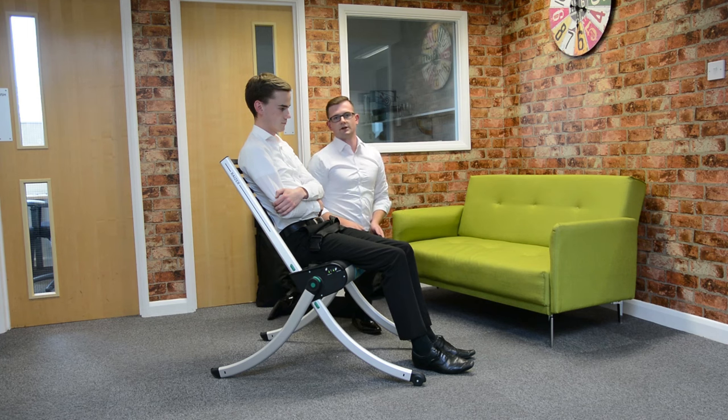We can stop at any point if they need to acclimatise to being raised up, and if they're ready to go at any point, we can continue.